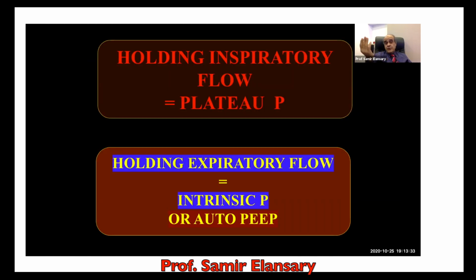How to measure plateau pressure? It is just holding the inspiratory flow. If you hold the expiratory flow, you will get the intrinsic PEEP or auto PEEP, which reflects dynamic hyperinflation, such as in cases of COPD or in patients with low expiratory time and so on.